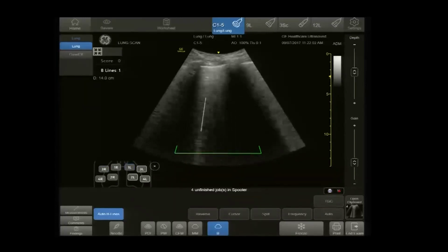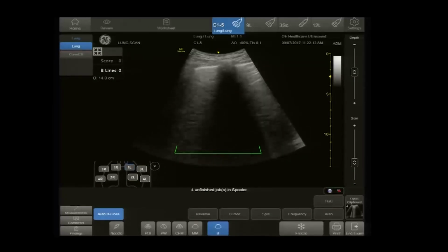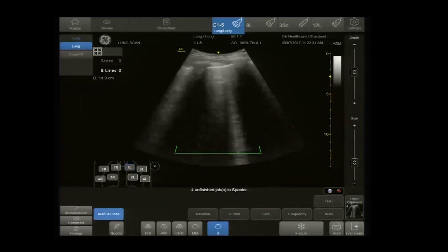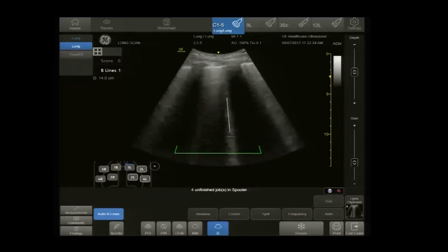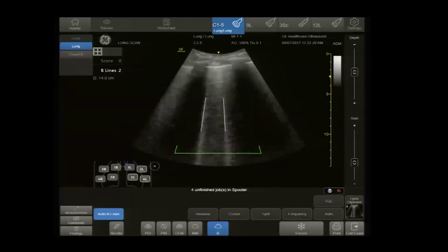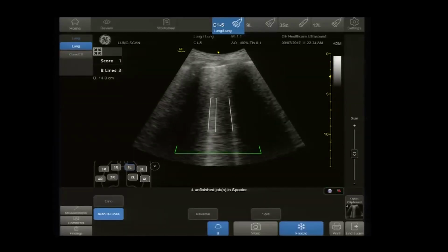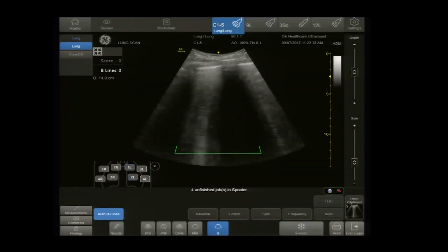One of the favorite tools associated with the lung ultrasound on Venue has to do with the screen of the lung review. And you can see right here I have a little pictogram that helps me as the scanner to actually go through the segments of the lung. That can be really important and a great time saver, because if I start, say, on the right side, it can actually just transition for me to the next lung zone. As soon as I'm happy with an image, I freeze and store, and you'll notice that it just transitioned to the second one. It's saving me a button press.